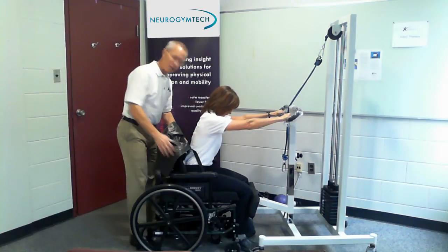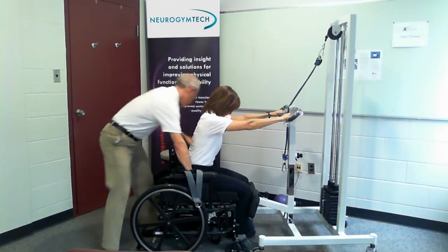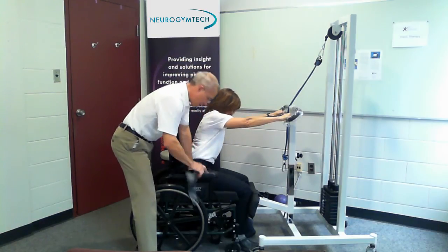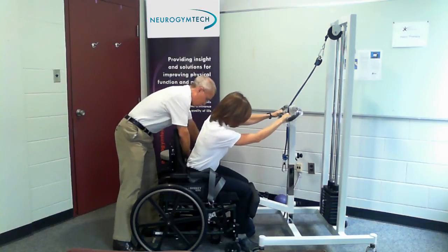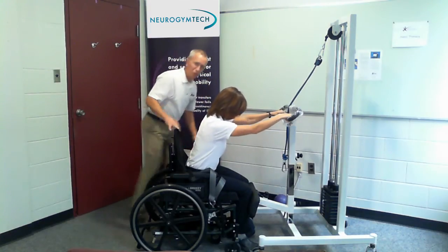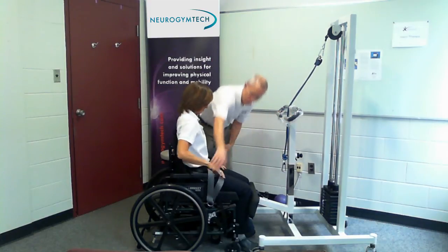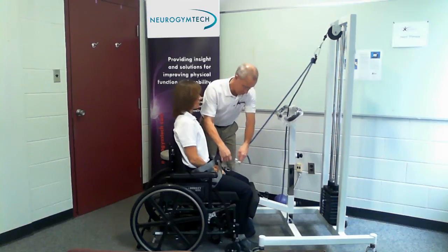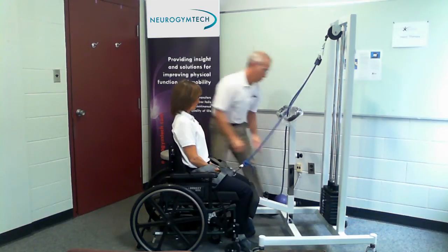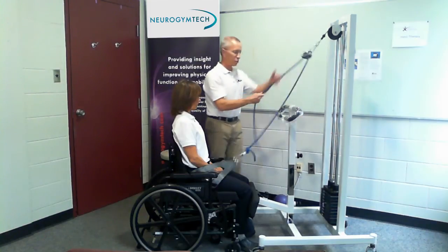This patient can't lift her bottom off the chair, so I'm going to tuck the sling down as far as I can. Then I get her to move a bit to the left and scooch, and a bit to the right and scooch — I'll show you a couple of tricks associated with this. Then I'll grab the two rings and connect the weights. We always connect 40 pounds and I'll explain why in a minute.